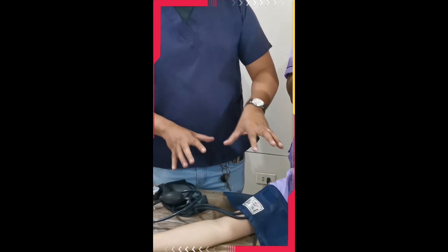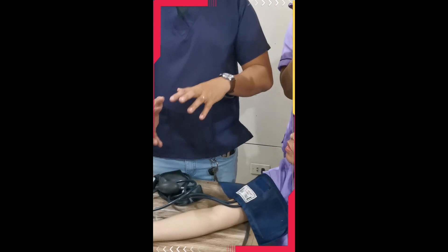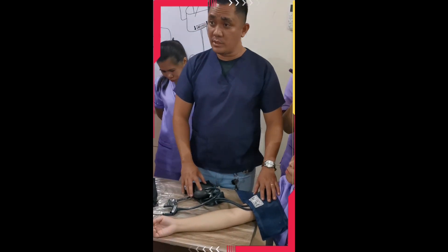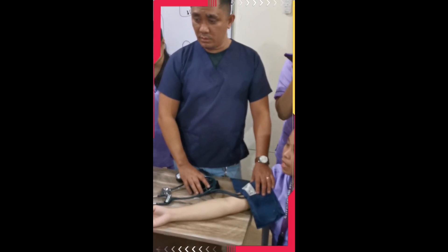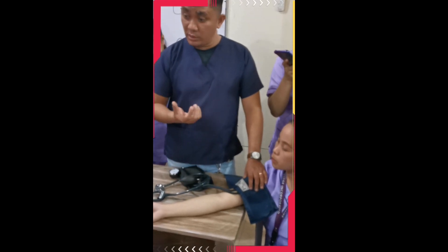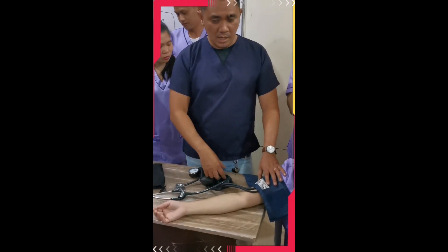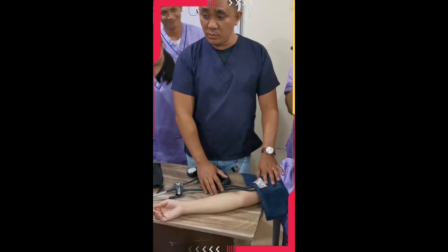Which arm should we use — left or right? Either arm is fine depending on what is available. But if given a choice, the left side is the best. Why? Because the left arm is closer to the heart, meaning the pressure is stronger and you can really hear it clearly when taking BP. The right arm is okay too, but if given a choice, prefer the left.